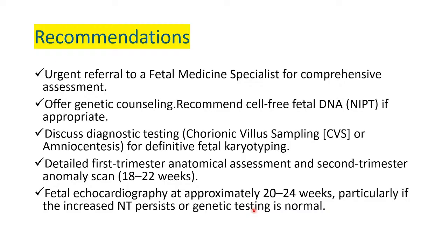You must also not ignore the ductus venosus. I'm going to show you how we do the ductus venosus in detail, and I'm going to give you the notes on how to do a first trimester ultrasound examination.